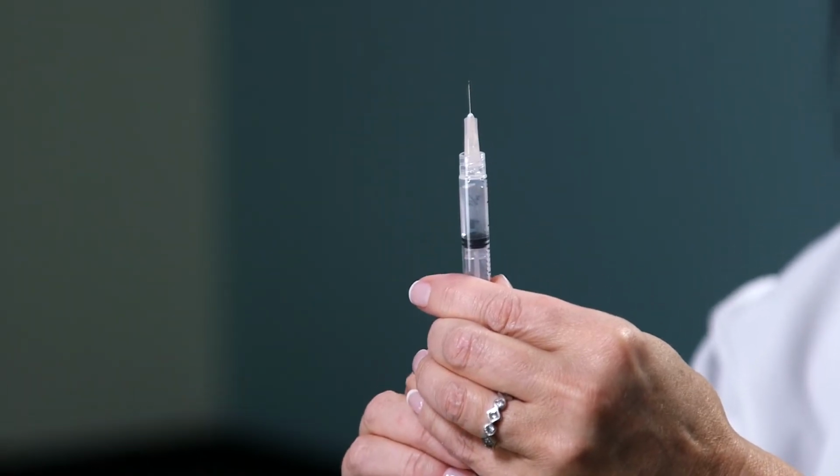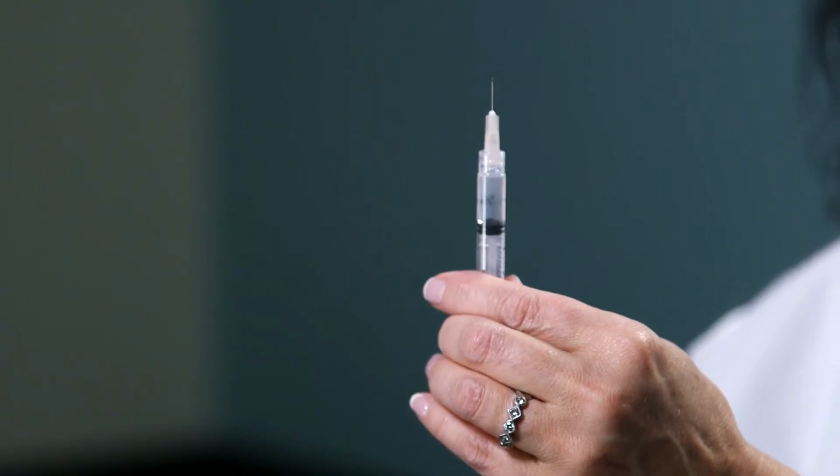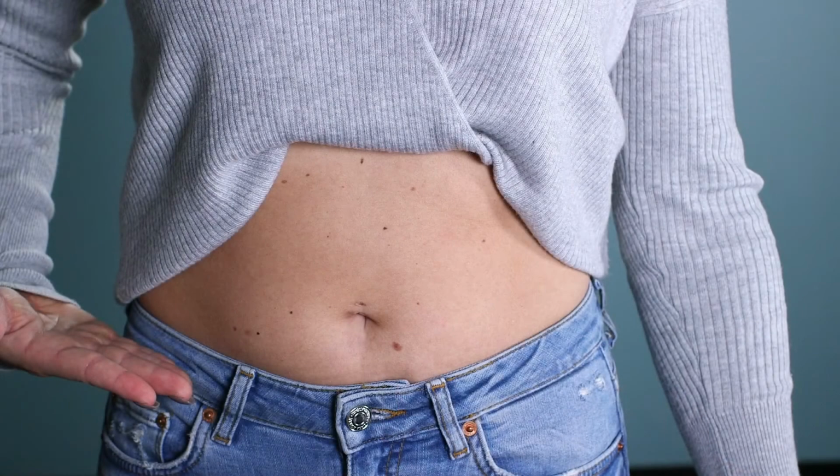Tap any air bubbles so that they rise up to the top, and push on the plunger gently until you see a droplet form, and you're ready for your subcutaneous injection. For subcutaneous injections, make sure you wash your hands with soap and water.